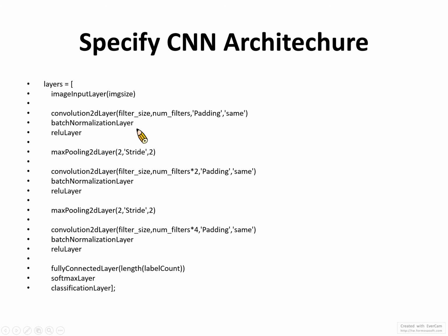You can see that the data will go through the first convolution, batch normalization and ReLU layers and the first step of max pooling, and go to the second iteration of convolution, normalization and ReLU, and the second round of max pooling, and the third round of convolution, but there's no max pooling this time, only flattening this data into the fully connected layers, and finally connecting to the softmax layer to give a probability of the classifications.